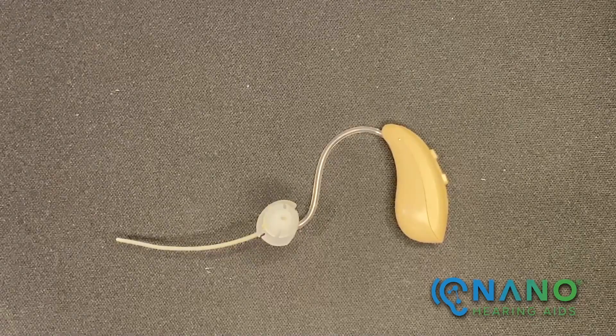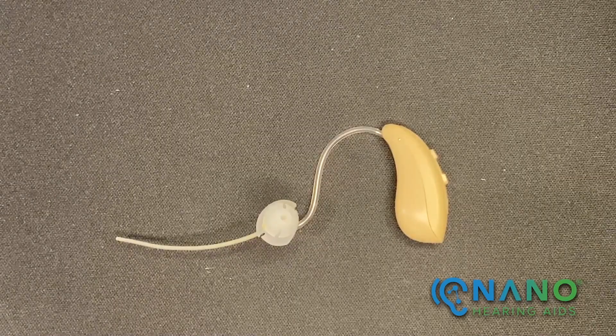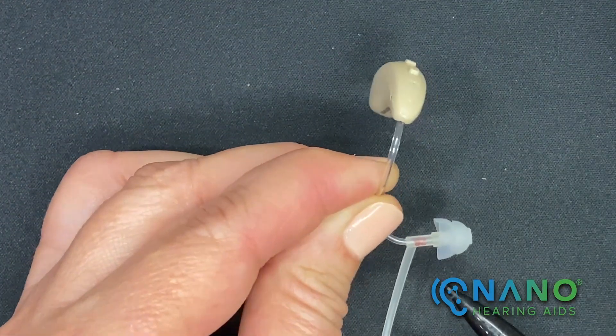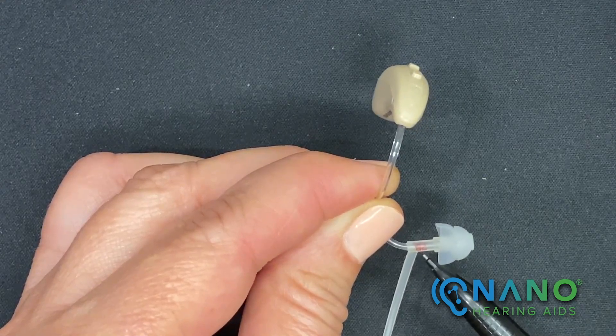The red indicator is for the right ear and the blue indicator is for the left ear. This hearing aid has a red indicator, so it's for the right ear.